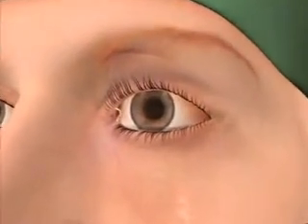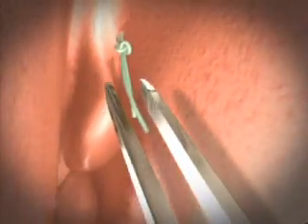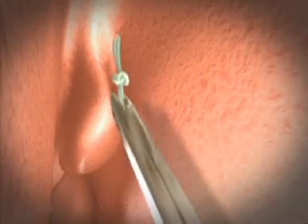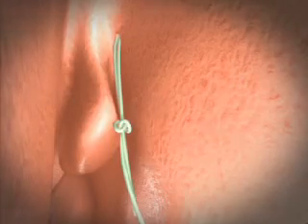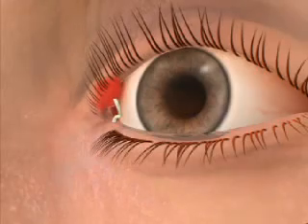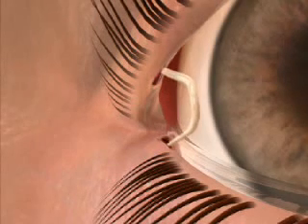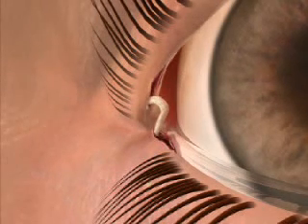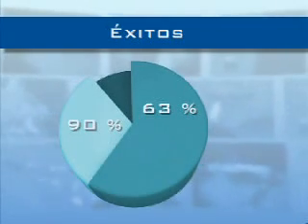Another complication we describe is lateral displacement of intubation. This can be easily resolved with the endoscope and is relatively unimportant if the tubing is withdrawn early and periodical washing is performed. We suggest early withdrawal of intubation at 3 weeks to prevent granulomas and duct laceration, and to obtain the best possible outcome. The success of this technique is between 63% and 90% according to various authors.